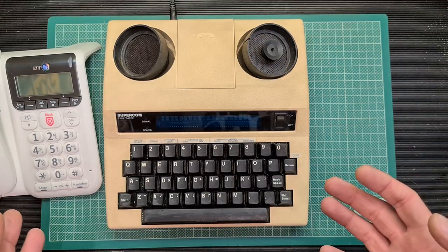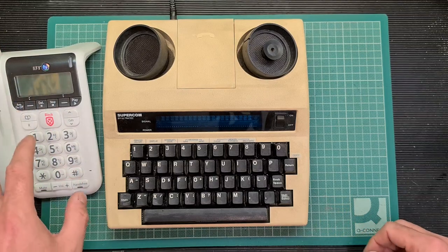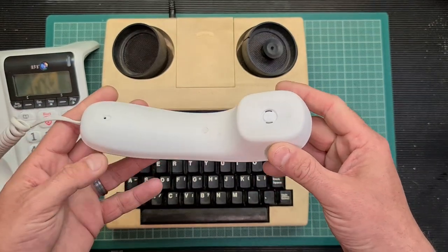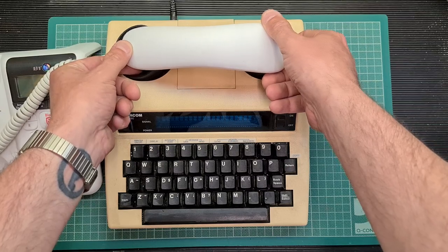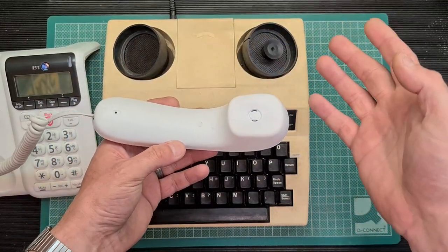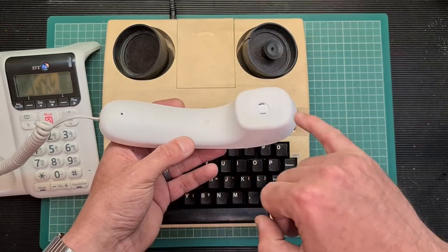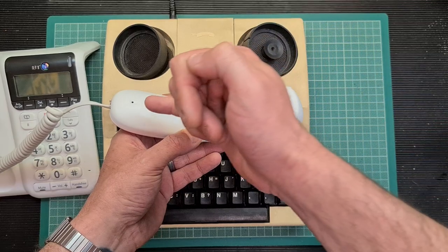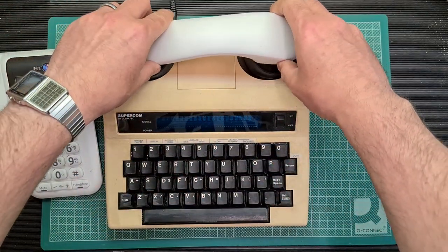What you would have is a standard telephone — clearly this is far more modern than the ones back in the day. You would take the receiver or the handset off the phone and then stick it on top of the device. It couples the audio, as the name would suggest, using the microphone and speaker. So the speaker of the handset would couple with the microphone of the device and the microphone of the handset would couple with the speaker of the device.